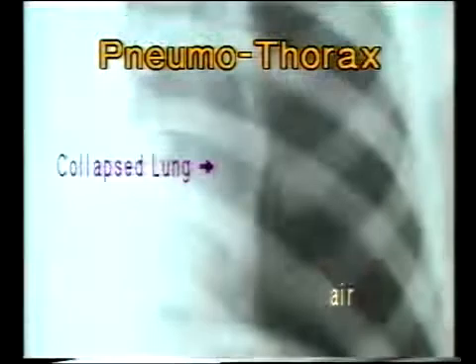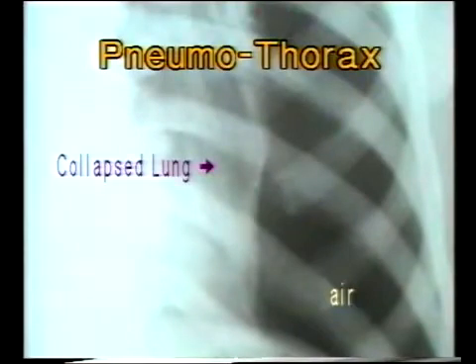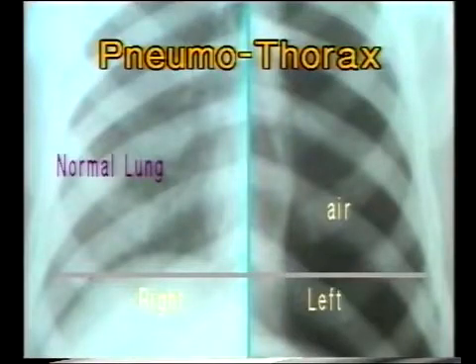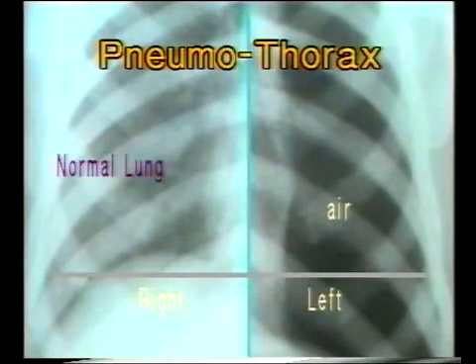Note in the close-up view the absence of bronchovascular markings over the pneumothorax and the sharp border separating it from the lung. Now compare the normal lung on the right side with pneumothorax on the left side. Absence of bronchovascular markings is better appreciated when compared with the normal lung on the opposite side.